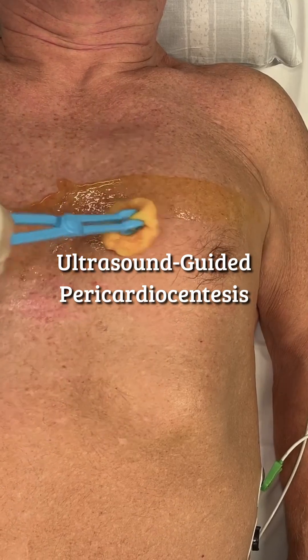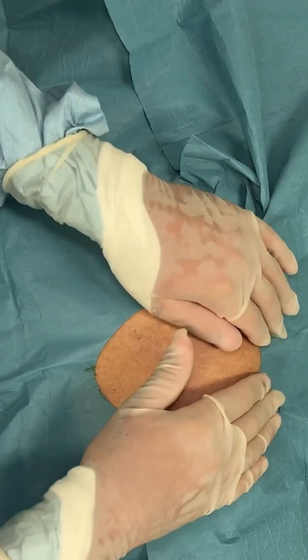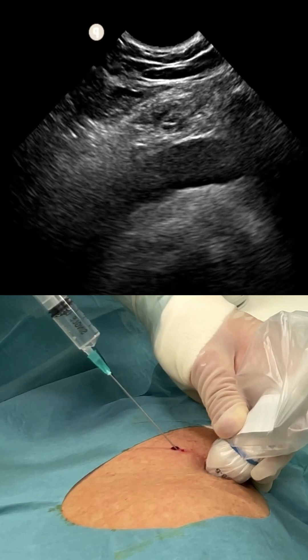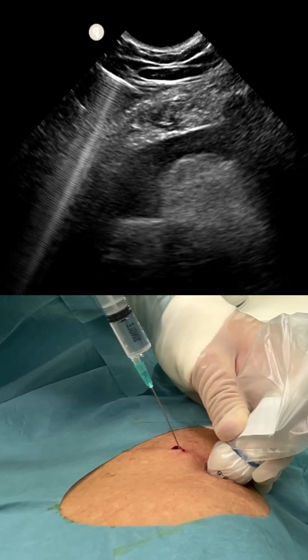The procedure begins with chlorhexidine prepping. Drapes are placed as shown. There's usually no need for sedation. Precise administration of 10 milliliters long-acting anesthesia using ultrasound guidance allows for a completely painless procedure.